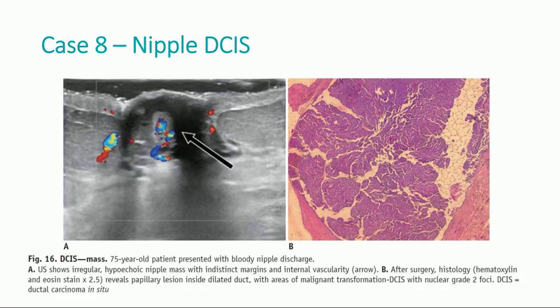In the category of nipple malignancies, we have a case of nipple ductal carcinoma in situ. The patient presented with bloody nipple discharge. The ultrasound shows an irregular hypoechoic mass with indistinct margins and internal vascularity. After surgery, histology reveals a papillary lesion inside the dilated duct with areas of malignant transformation: a ductal carcinoma in situ, grade 2.